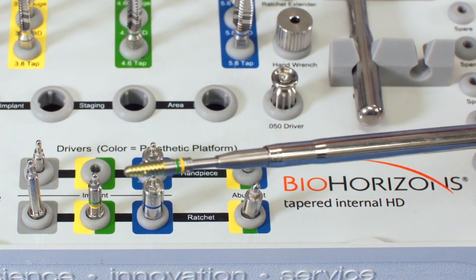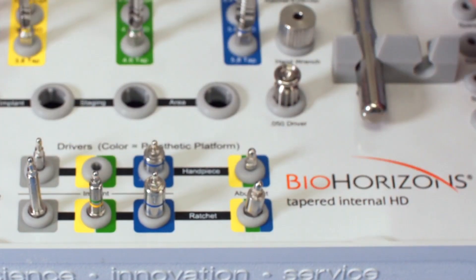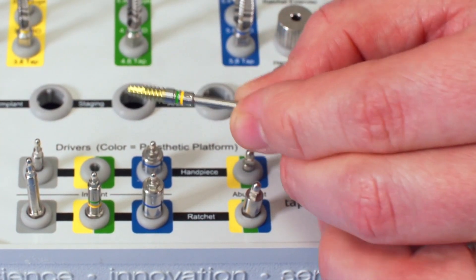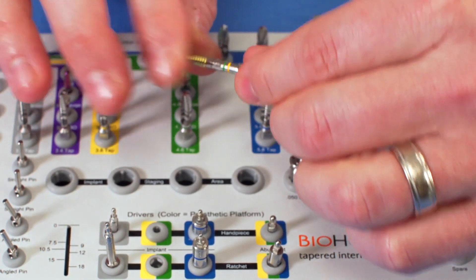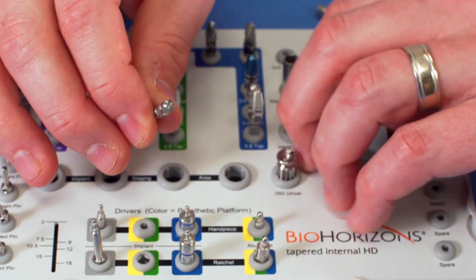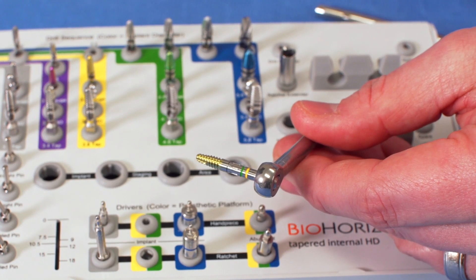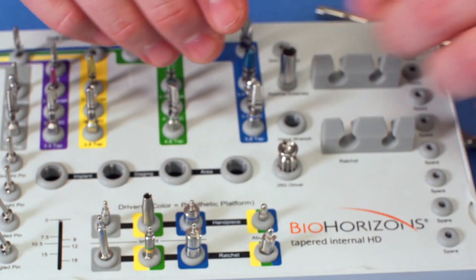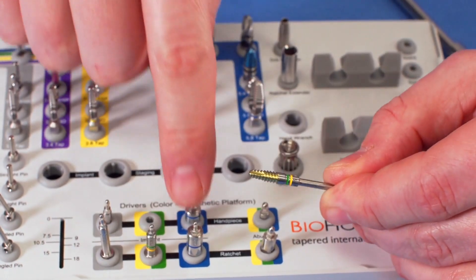After drilling, you insert the implant. The implant is picked up with the latch driver, which you place in your implant handpiece, pick up the implant from the package, and insert. They also make a hand driver so you can start with a hand driver, insert into the osteotomy, and finish with a ratchet. So you have the availability to deliver with the surgical handpiece and the ratchet handpiece, cranking down to the final proper position. The yellow and green connections share the same driver; the blue 5-7 implants have a separate driver.